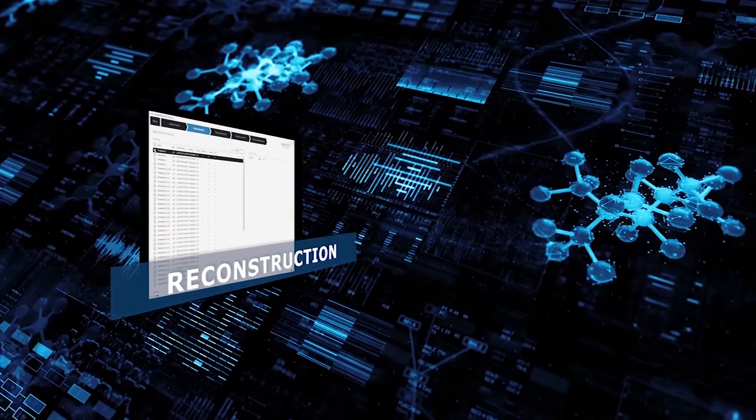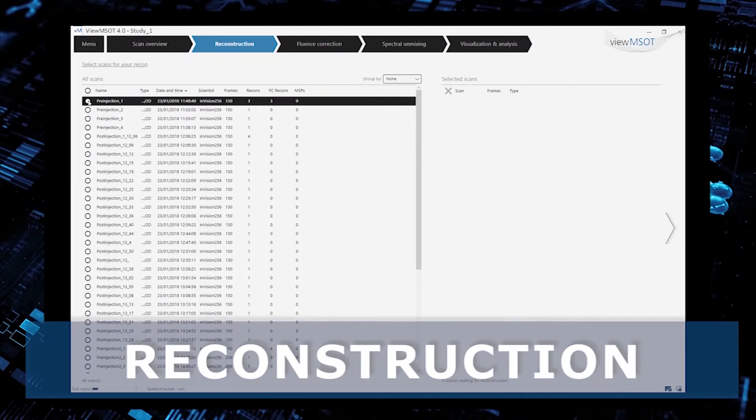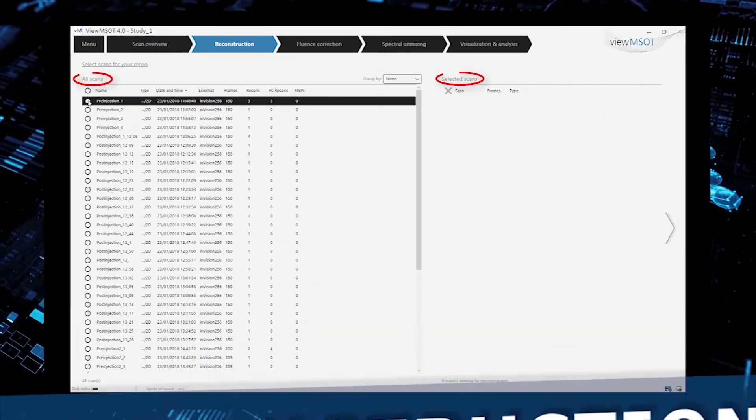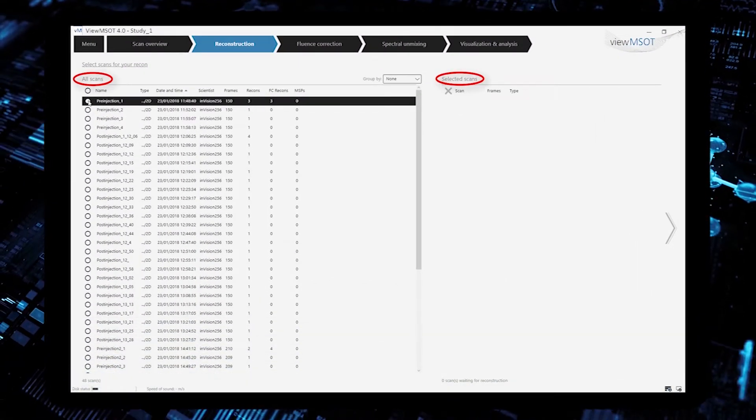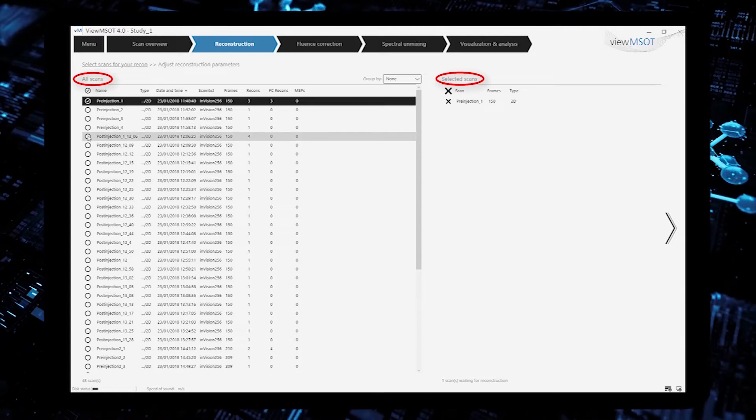Let's take a closer look at the individual processing steps. In reconstruction, you first choose the scans to be reconstructed.